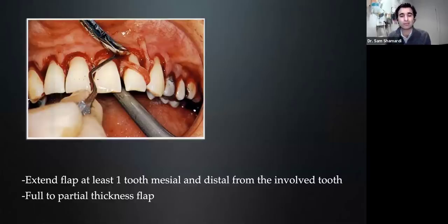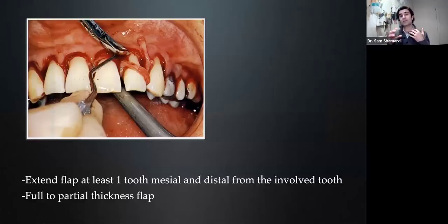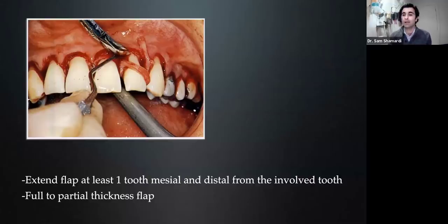It's very critical that the flap is extended at least one tooth mesial and distal from the involved tooth. There are a couple of reasons: the tension applied on the flap — if we don't extend it far enough, we won't get proper reflection, it will create a lot of tension, tissue tears, and it's going to impede our ability to see the surgical area. After we do that, we can raise our full thickness flap all the way down to the mucogingival junction, which we can then switch to partial thickness.